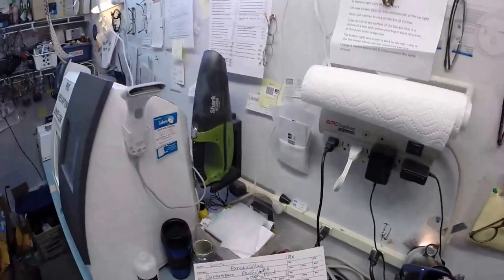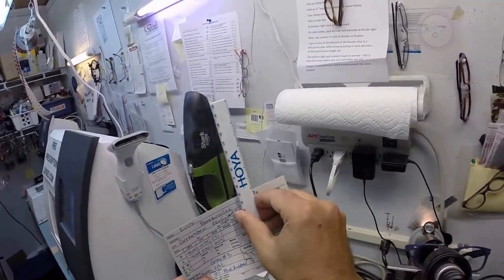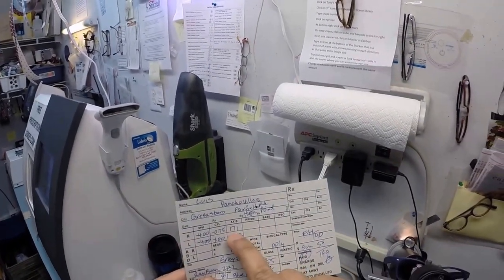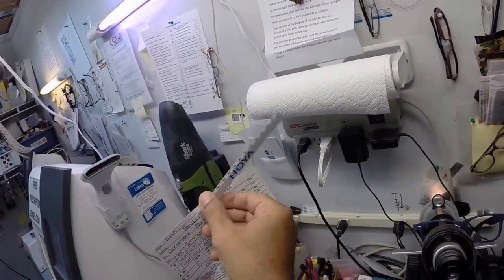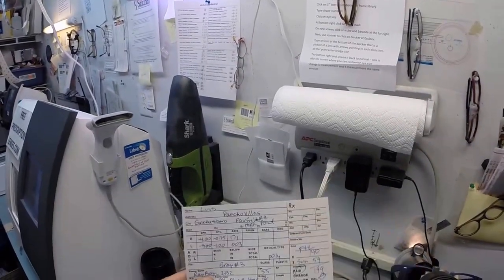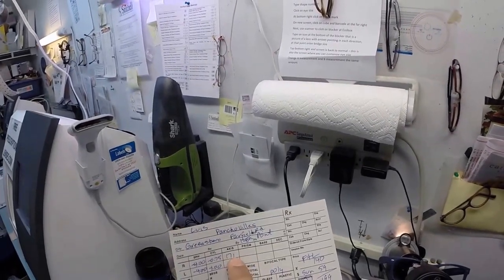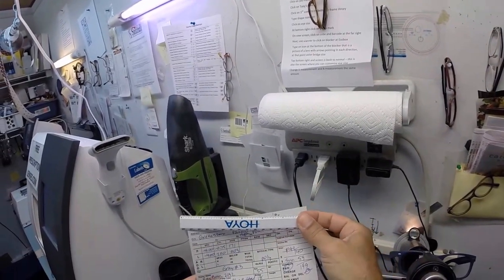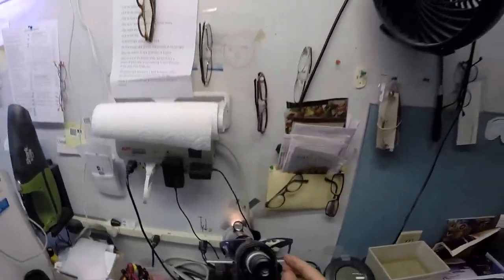We're going to turn that knob to 171 for your right eye. A straight line is zero to 180. A zero over here by your name, 90 in the middle, 180 here, and 270 at the very bottom for those keeping score at home. We're going to turn that knob to 171. We're going to start here at zero, turn that to almost at the 180 mark. Now, for the left eye, we're only going to turn to three, which is right here. You would think those numbers 171 and three are very far apart. They're not. You actually only need nine degrees away from the 180 on this side. You're only three degrees away from the 180 on this side, so you're very close to the 180 meridian.